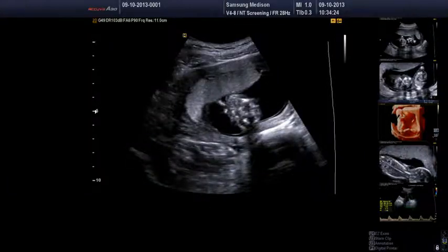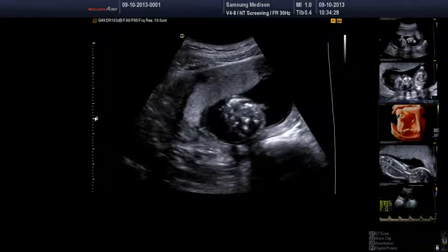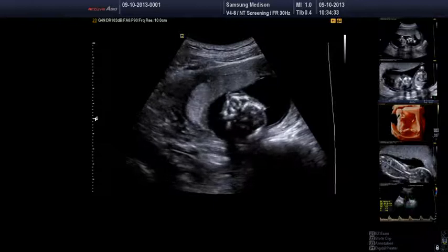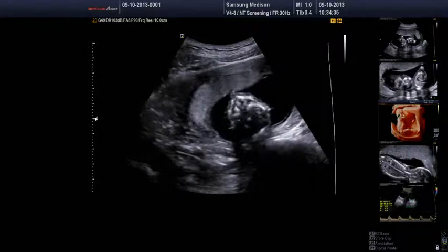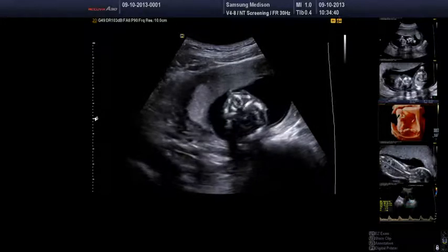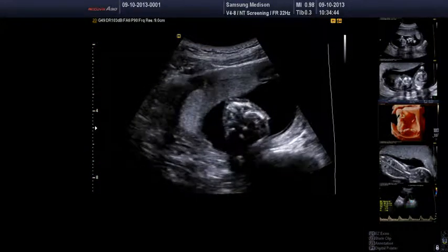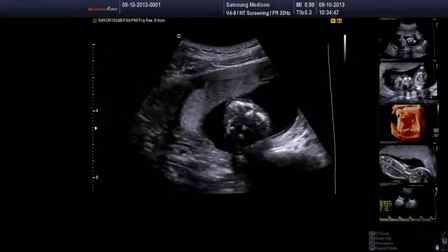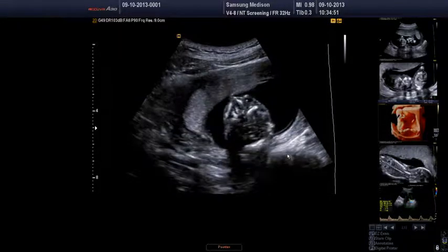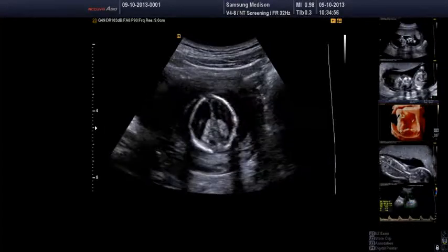So we're going to start by doing a first trimester scan. It might just be worth saying something about where I'm sitting. I'm sitting on the side of the couch right next to our patient here, and the reason is that I find it puts much less stress on my musculoskeletal system if I'm both close to my patient and also to the keyboard. So anyway, we're off now, so we're going to start doing a scan here.